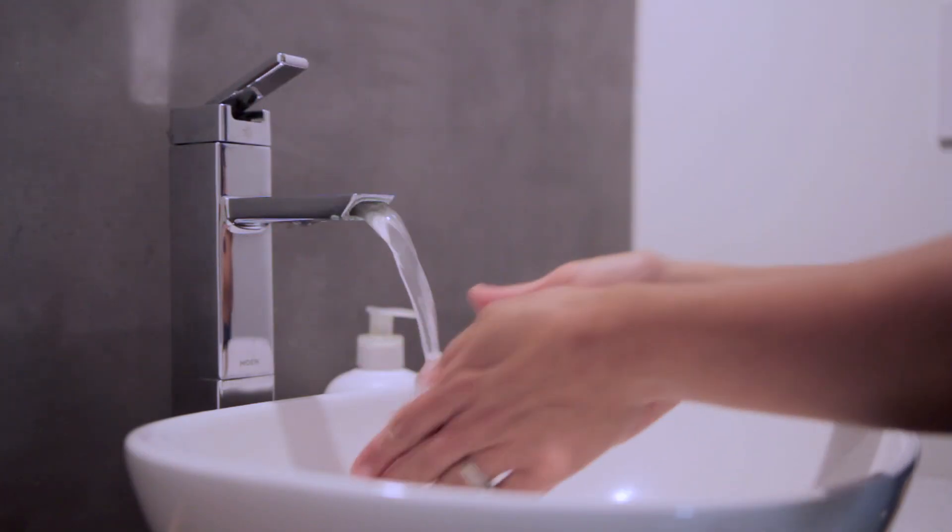Before I dive into the live demo, levofed should always be administered through a smart pump in an ICU setting with a patient on a continuous monitor, with vitals every 15 minutes if they don't have an A-line. Before you prepare your drip, wash your hands and verify your six rights: right patient, right medication, right dose, right time, right route, and right documentation.